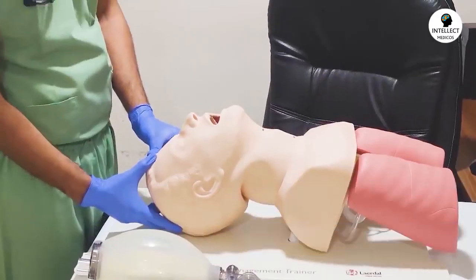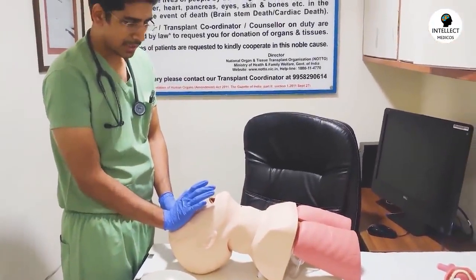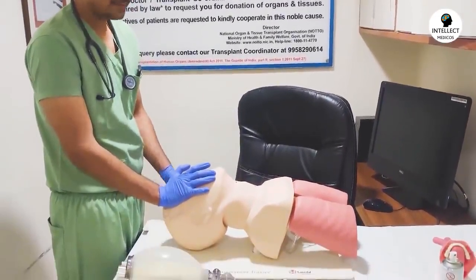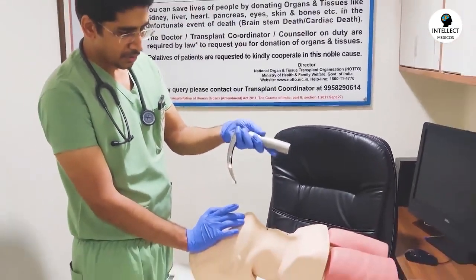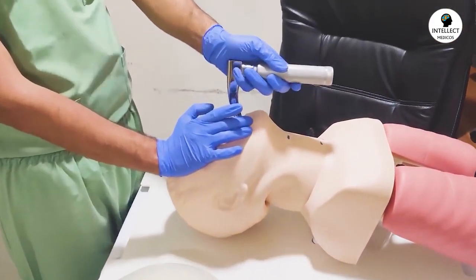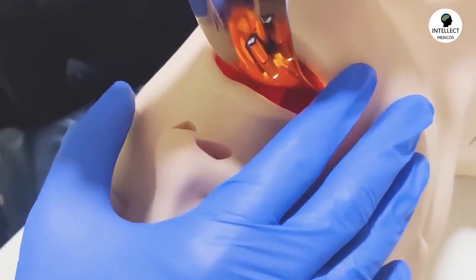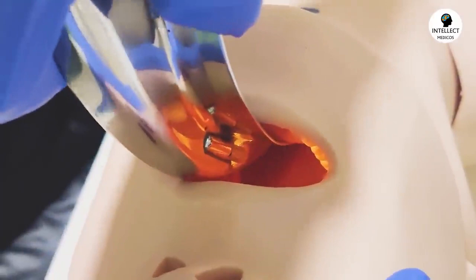And then you have to hold the head over here with the heel of one hand over the forehead of the patient, and you yourself have to open the mouth of the patient like this with the fingers, right? And now holding the laryngoscope in your left hand, you go inside and deviate the tongue from right to left. Now come on to the inside of the mouth. Now I'm inside. As you can see, there is the tongue which I have deviated from right to left. Now I'm going inside till I see the epiglottis.